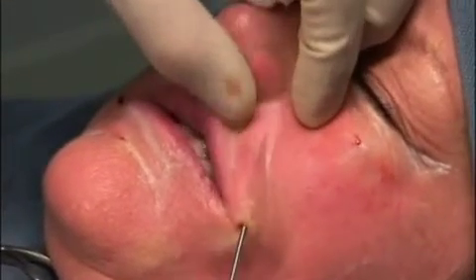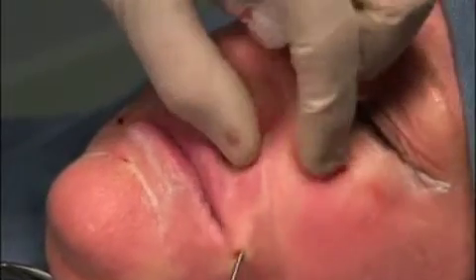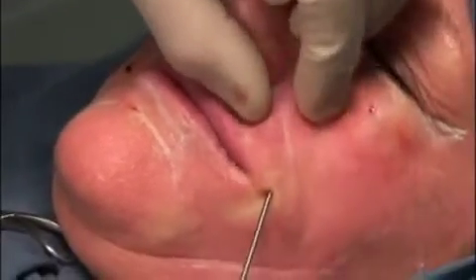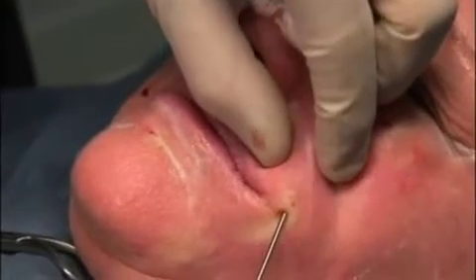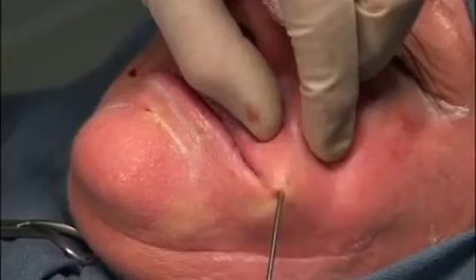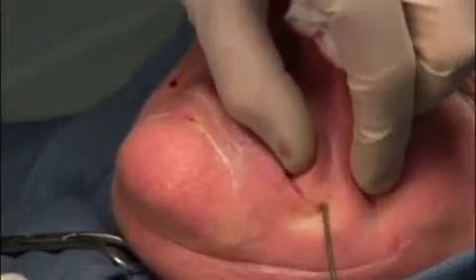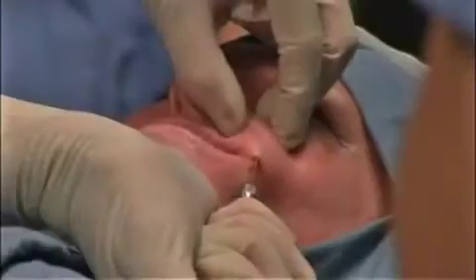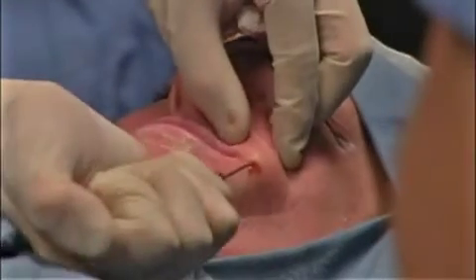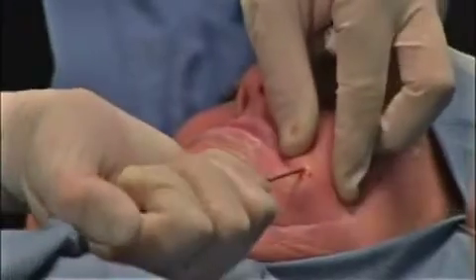This presentation illustrates facial fat grafting. However, the tremendous advantage of the body jet is the significant amounts of concentrated fat that can be acquired without any purification. This large amount of fat can be injected anywhere in the body, including the breast for repairing asymmetries or producing a mild augmentation, filling in areas of depressions and indentations, such as with cellulite, and augmenting the buttock area, producing a Brazilian butt lift.